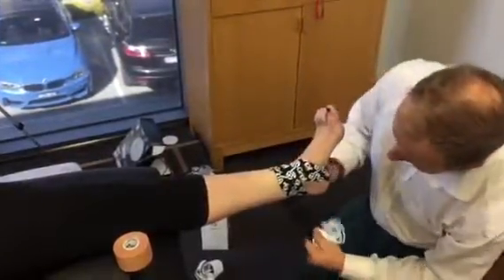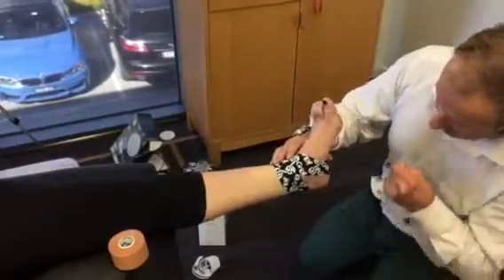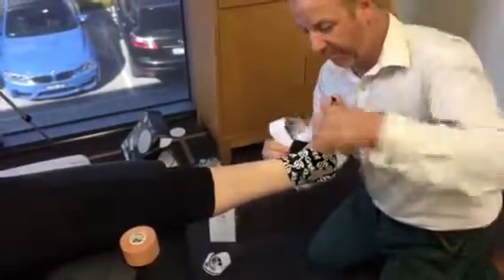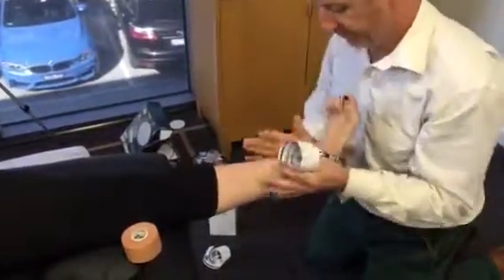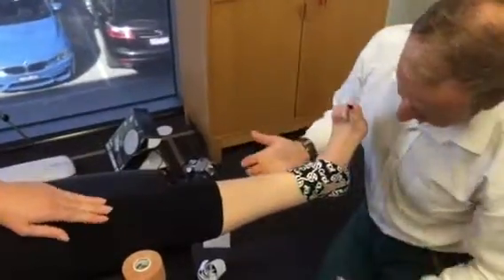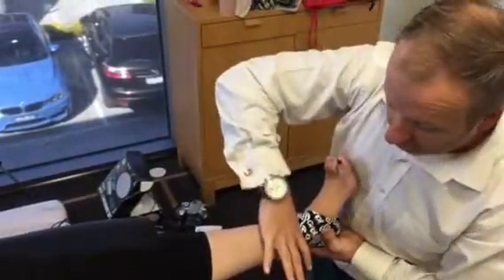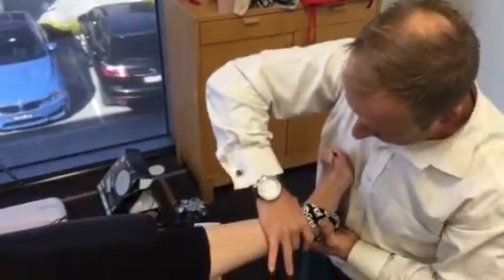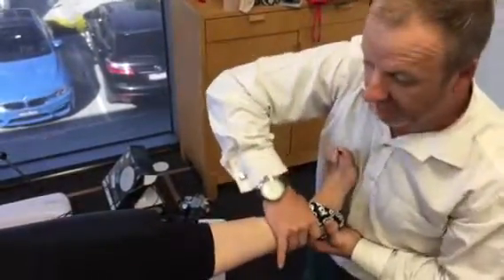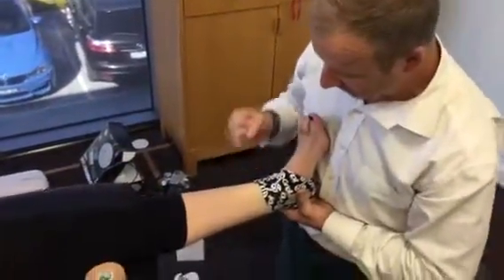The second one is similar, but the other way. You can see that leverage there — come around just like a heel lock, and bring the tape back up with no stretch on the ends, to where it started. So it's effectively like a couple of heel locks that put real leverage on the skin, giving us this anterior-to-posterior glide of the tibia on the talus, which then protects against that tibia shearing anteriorly — which can cause lots of problems for people in running sports that get that natural shear.